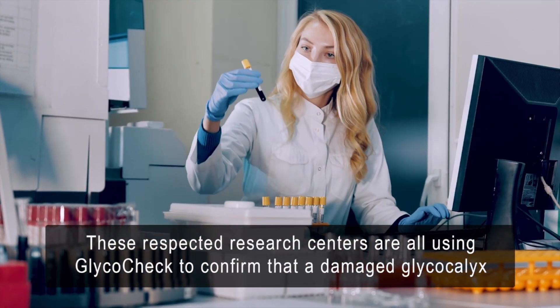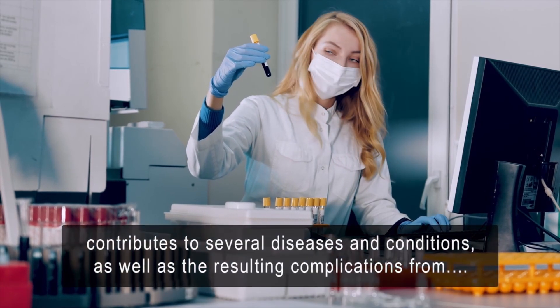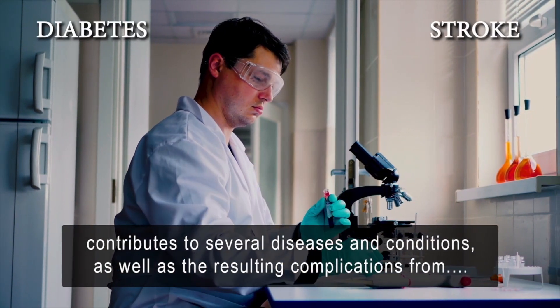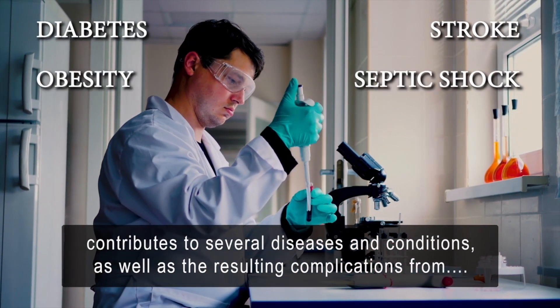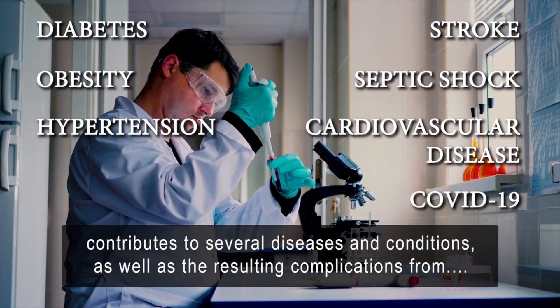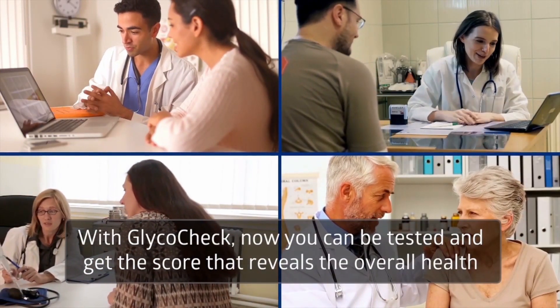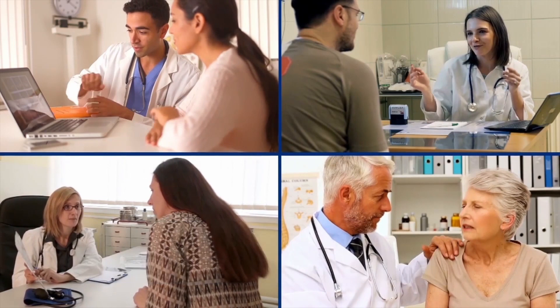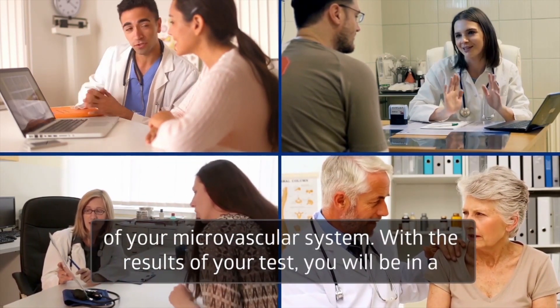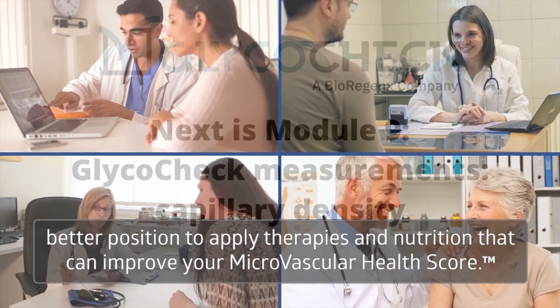These respected research centers are all using GlycoCheck to confirm that a damaged glycocalyx contributes to several diseases and conditions, as well as the resulting complications from diabetes, stroke, septic shock, obesity, cardiovascular disease, hypertension, COVID-19, and other diseases. With GlycoCheck, now you can be tested and get the score that reveals the overall health of your microvascular system. With the results of your test, you will be in a better position to apply therapies and nutrition that can improve your microvascular health score.